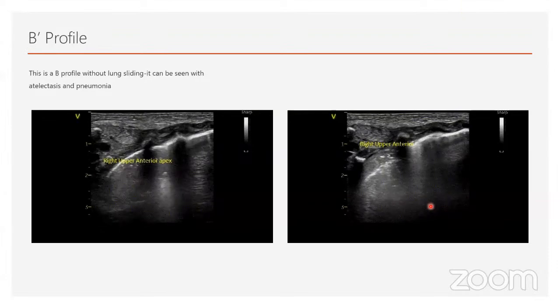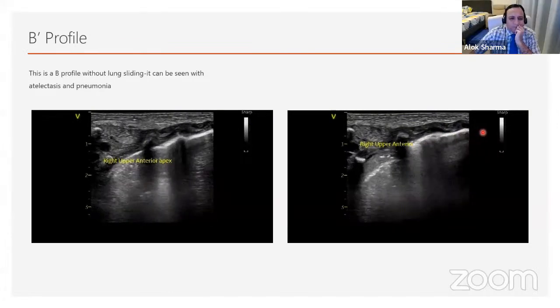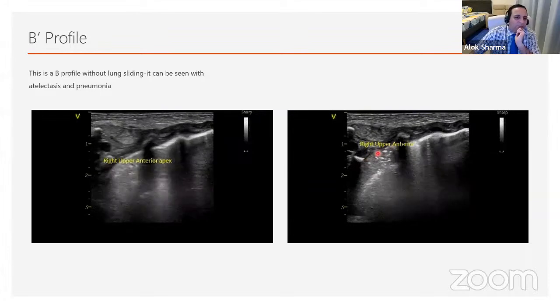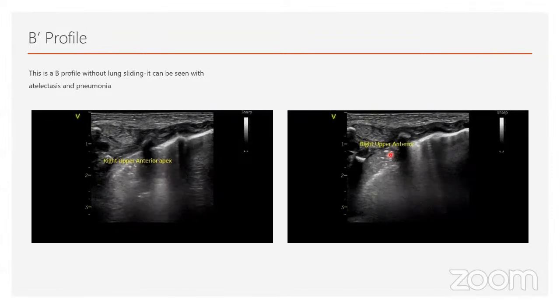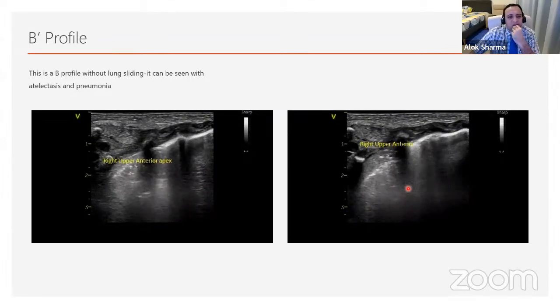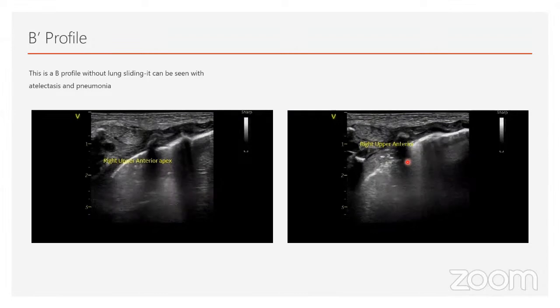In the right, so we can see the pleural line at the right part of the picture, but then at the left we don't see it in the same level. Okay, so what is that there? This is the consolidation? Yeah. Theoretically, they're both consolidations, but the question is which of these is atelectasis or collapse? Okay, we can see. Probably here is the atelectasis, no?